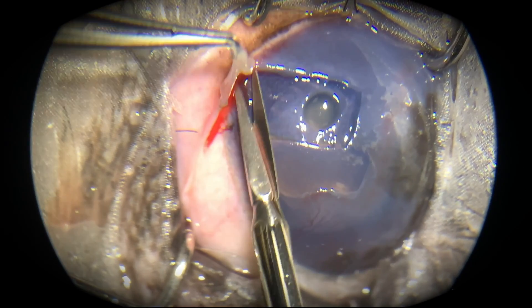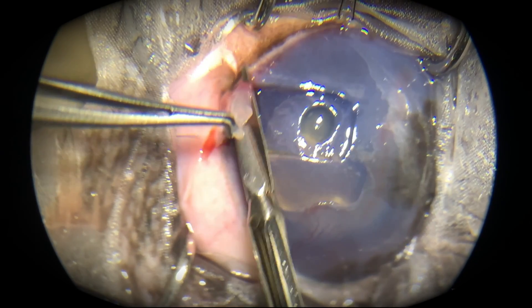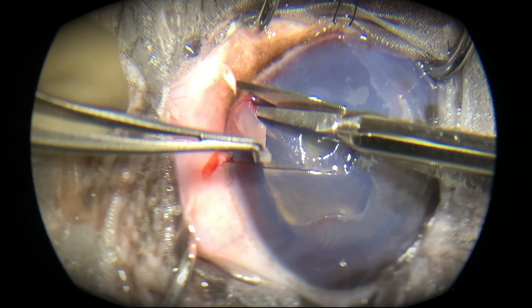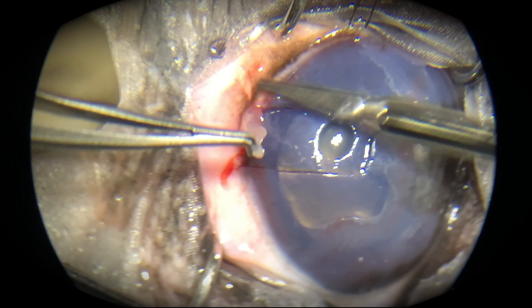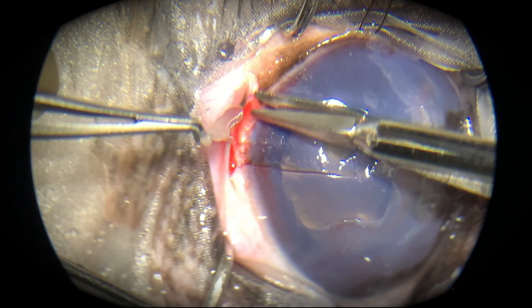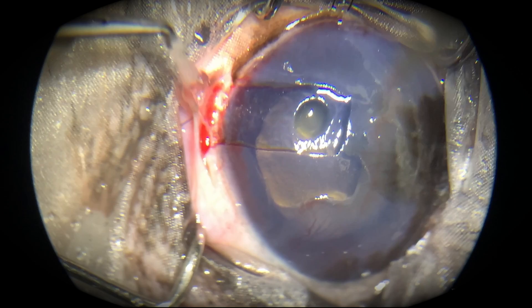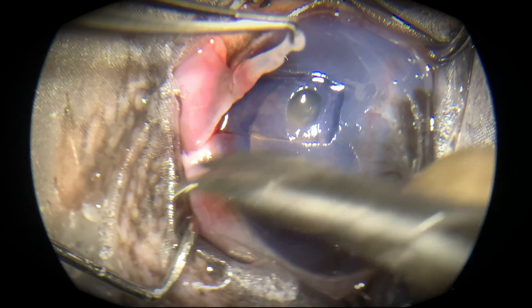Now we are separating the conjunctival portion of the graft. What's being cut right now is the limbus — the junction between the cornea and sclera. This thick, beautiful junction normally does not allow blood vessels in unless there is an injury. Due to the injury, the limbus was allowing blood vessels onto the corneal surface. The limbus has now been separated.